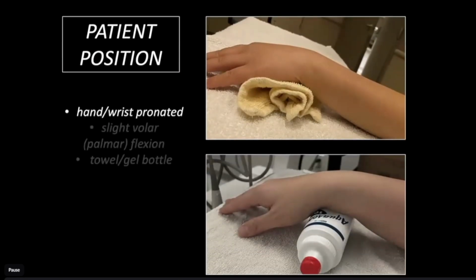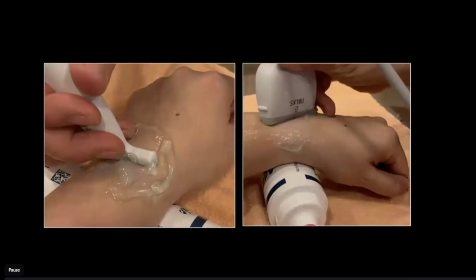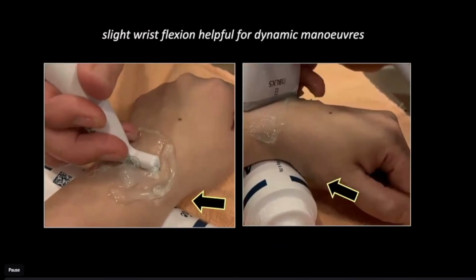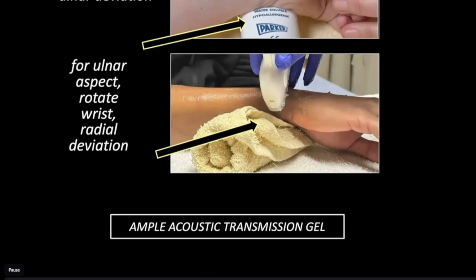You want to have the hand and wrist pronated with slight volar flexion. You can easily use a folded up towel or the gel bottle. Always we have an extra gel bottle on hand. Also, that little bit of volar flexion can be useful when you're doing dynamic maneuvers. For the radial aspect, you want to rotate the wrist and have a bit of ulnar deviation. For the ulnar aspect, you want to rotate the wrist and have some radial deviation.